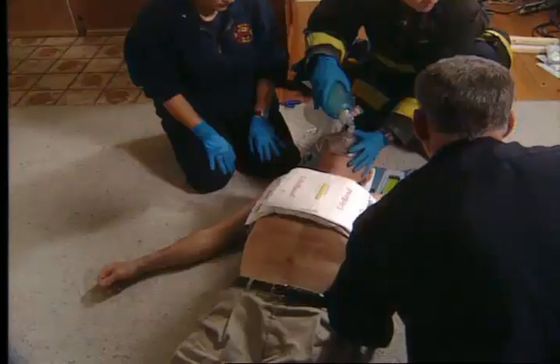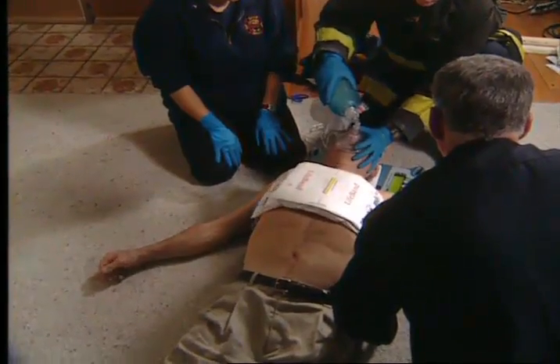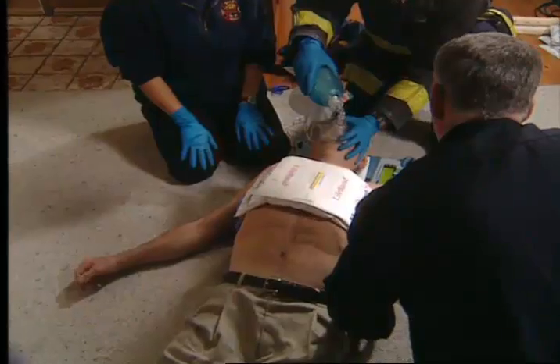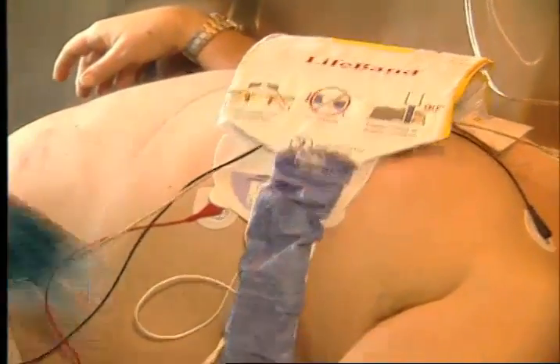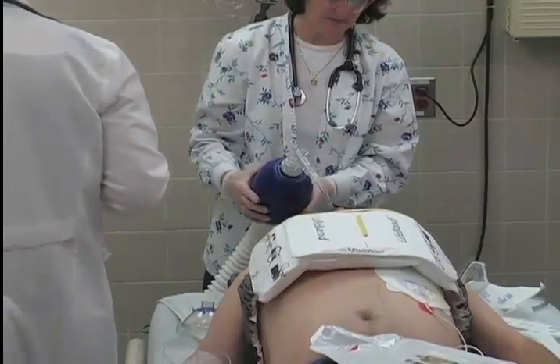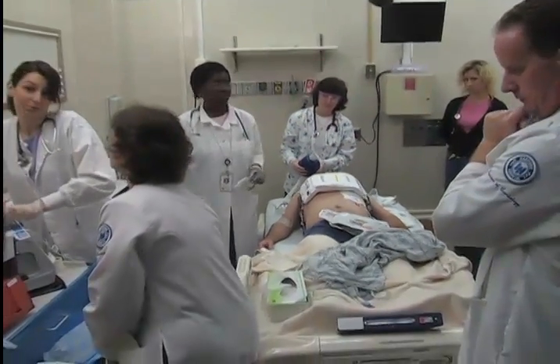As the Autopulse is operating, you may see things not normally seen during manual CPR. During compressions, you may see some undulating movement of the abdomen. In large patients, this movement may be quite pronounced. Although the Autopulse may look forceful when in active operation, it applies only the force necessary to compress the chest the same amount as manual CPR. This force is applied over a much wider surface area by the load-distributing lifeband.